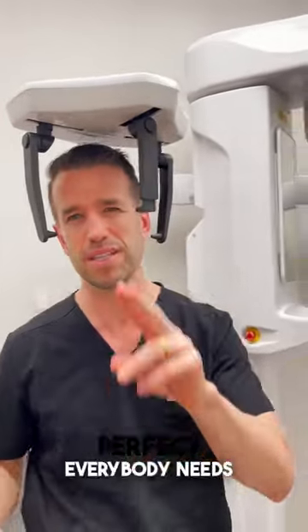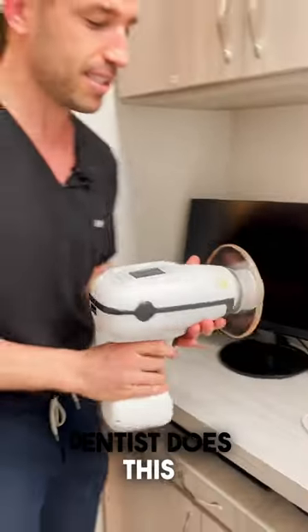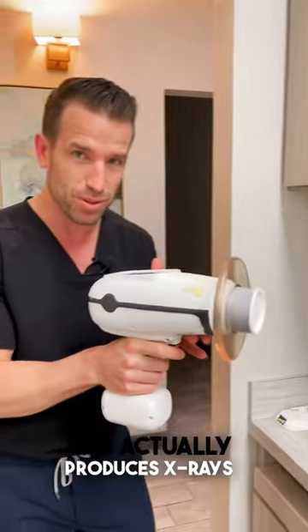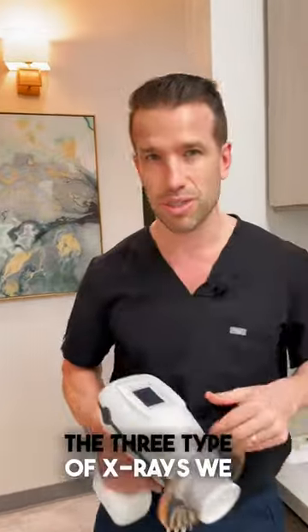Everybody needs it if they're doing braces or Invisalign. The other type of x-ray we do — the general dentist does this — is individual x-rays with this little device here. This actually produces x-rays, and there's a digital sensor on this side. So those are the three types of x-rays we do here.